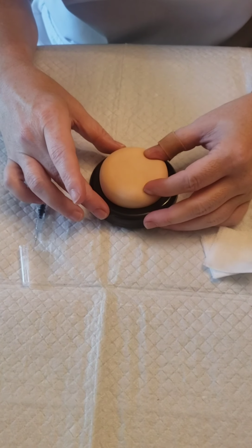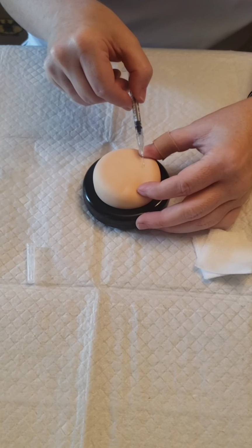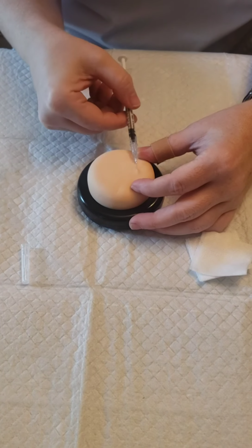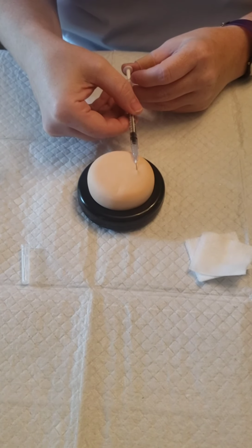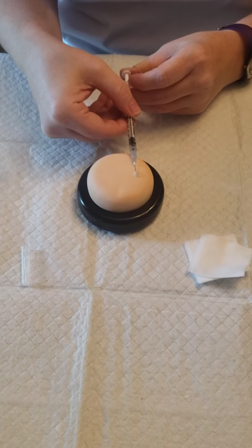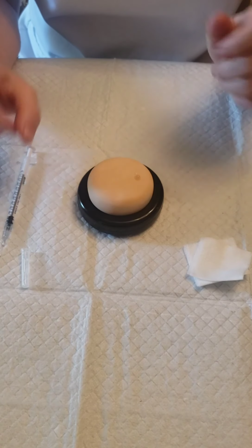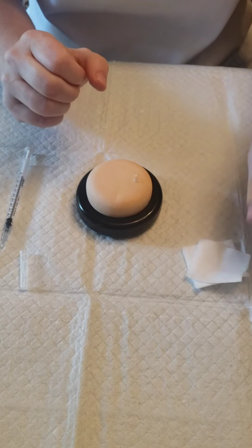I would stretch the skin between my thumb and forefinger. I'm going to take my syringe with the bevel up. I'm going just under the skin at a 5 to 15 degree angle. And I want to create a 10 millimeter wheal with my solution. And I know that's not 10 millimeters, but unfortunately using this skin pad, that's probably about as good as I'm going to be able to get.